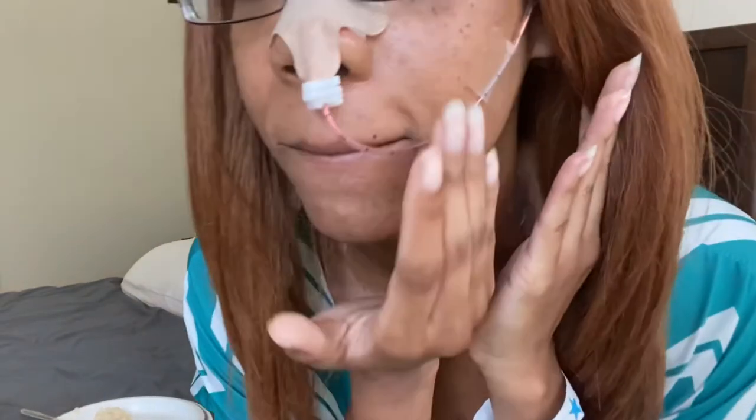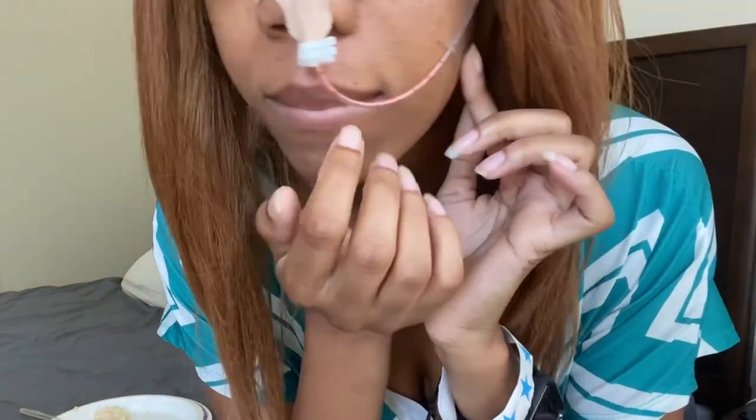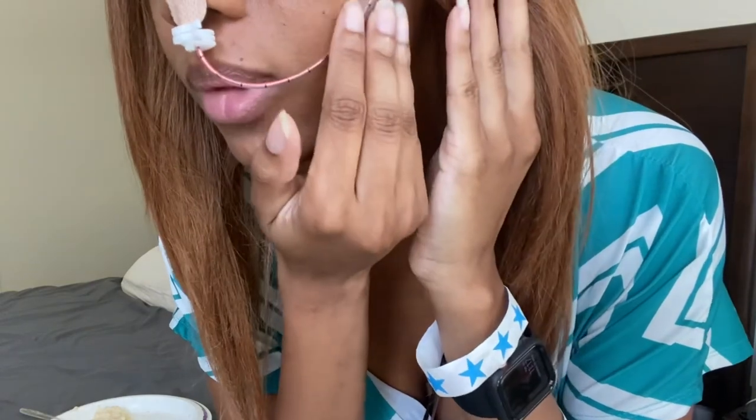So I'm swallowing the water. She gets the tube down. Once she gets it down, she places it, and then she has to secure it to the side of your face. So I'm going to show you here. So here it is. Piece of tape.